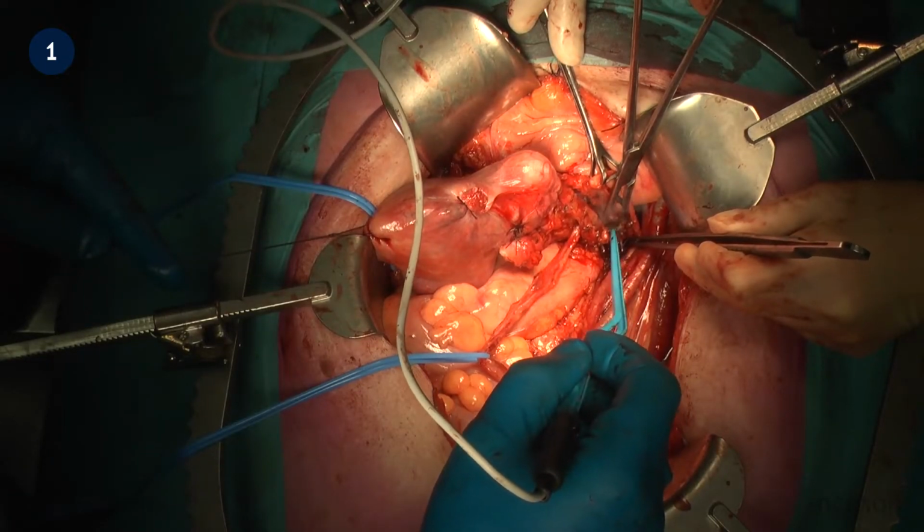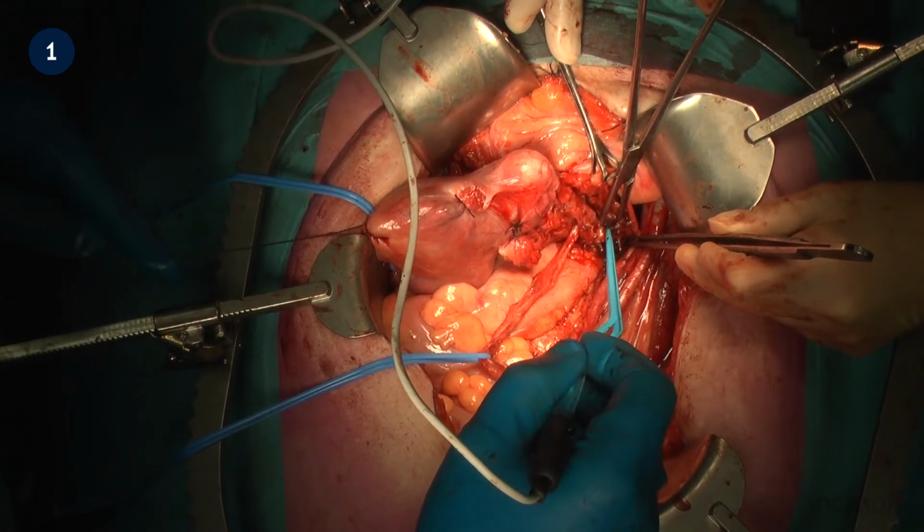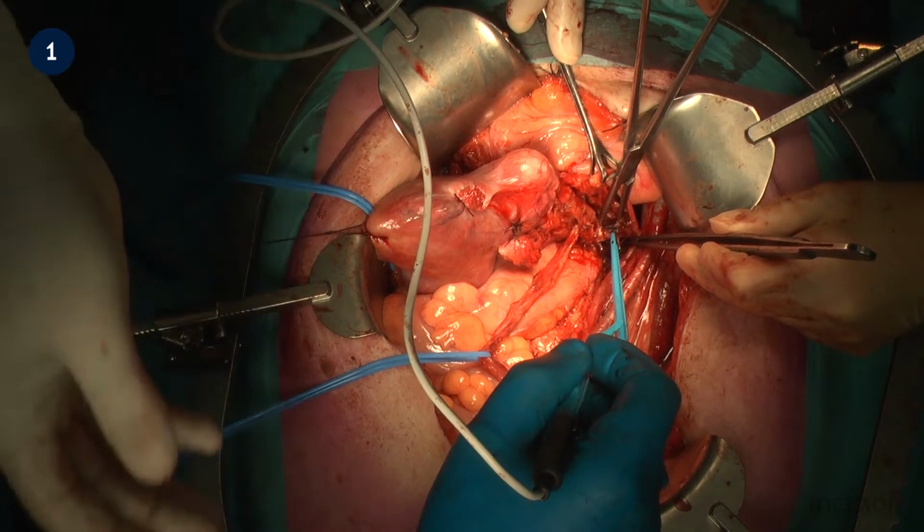Today, electrosurgery is used in approximately 80% of all surgical procedures, as it is an effective tool for cutting and coagulation. These effects are achieved by heat generated due to a controlled amount of electricity flowing through tissue.